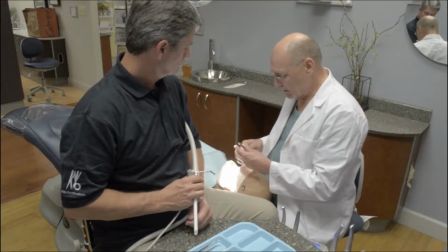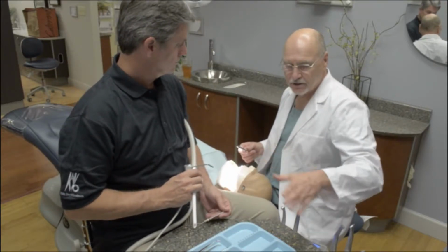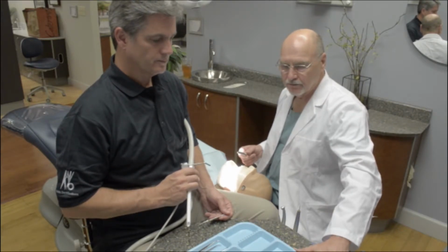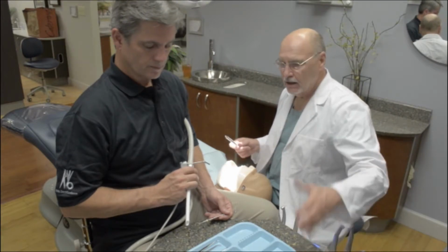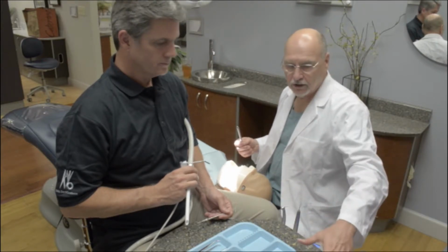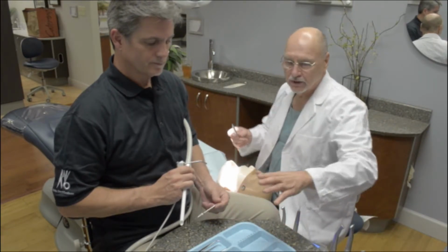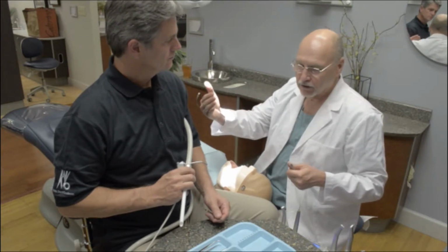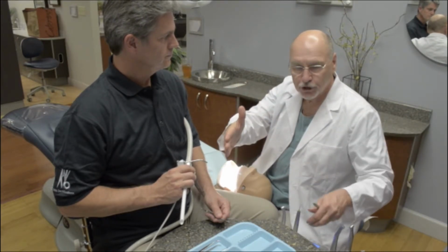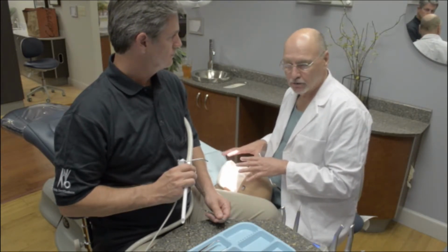So we're going to have the instrumentation brought up, and as we do, I also want to recognize the positioning of this workstation. The workstation is a deceptively important piece to the puzzle. In this flexible rear delivery setup, in order to deliver ergonomic care, we're going to have the surface of this workstation angled at a 45-degree angle outwardly, so that if we thought of the axis as being straight up and down like this, we're actually angling this workstation outward, giving the assistant and the doctor more work area right over the patient.